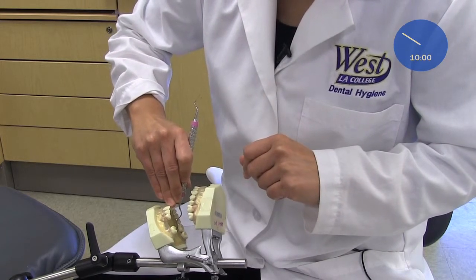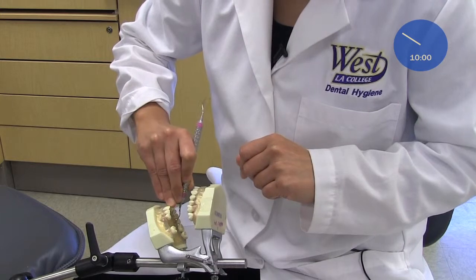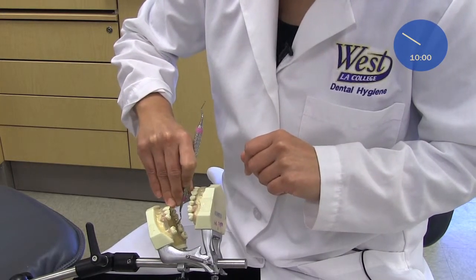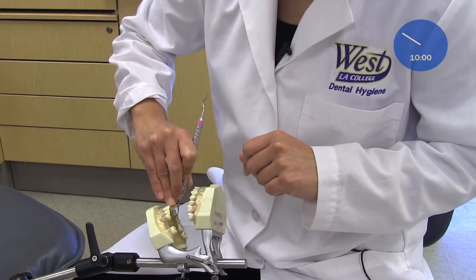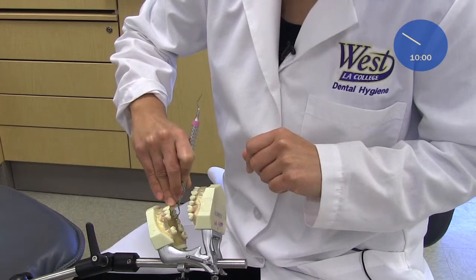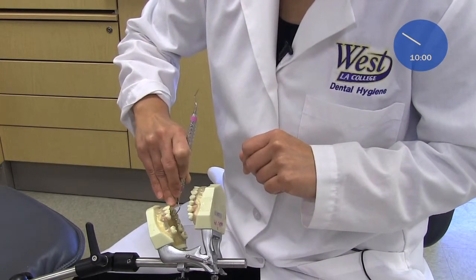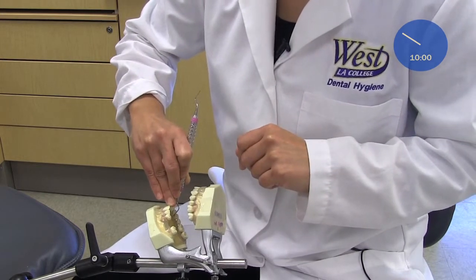Going to the distal, and then straight distal, up and down. Distal-lingual line angle, up and down. Then lingual into interproximal. So you're going to finish the premolars.